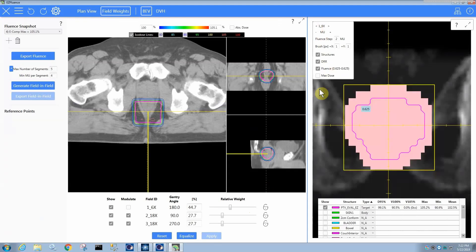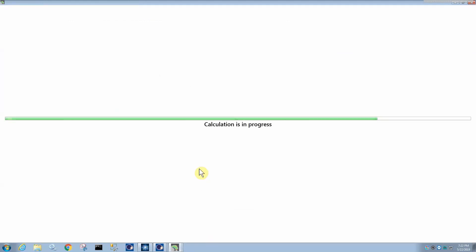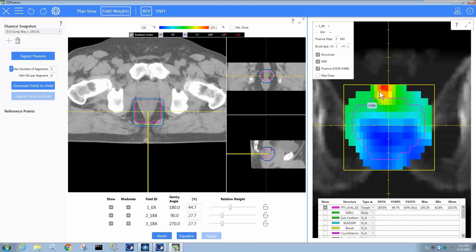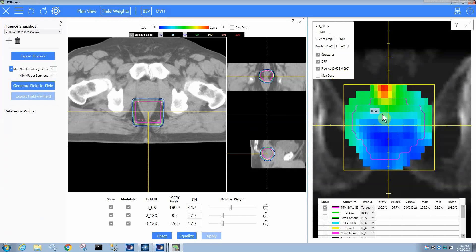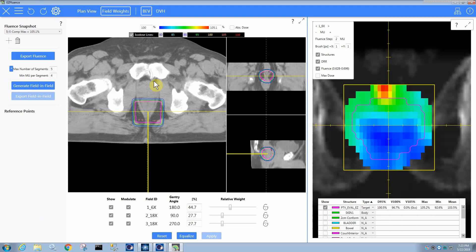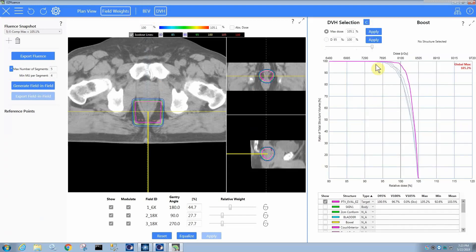And of course we could modulate this beam as well if we wanted to, but you'll probably find that you see this fluence range right here, 0.628 to 0.696. It did modulate it, but it's not very modulated because it's only about a 10% modulation from the least fluence intensity to the highest fluence intensity, which makes it a pretty good case for maybe not modulating at all. But if you do modulate it, of course, the DVH is going to be really nice anyway. So it's up to you.